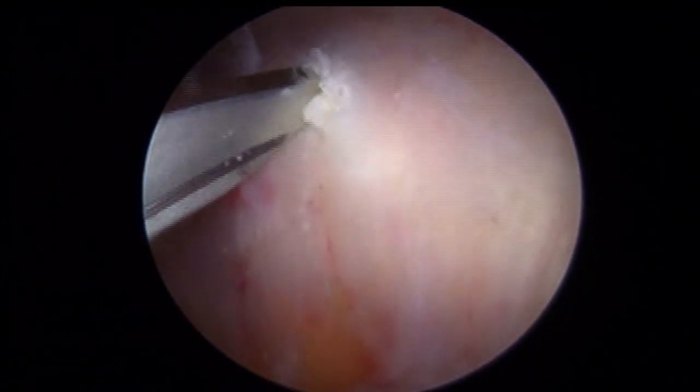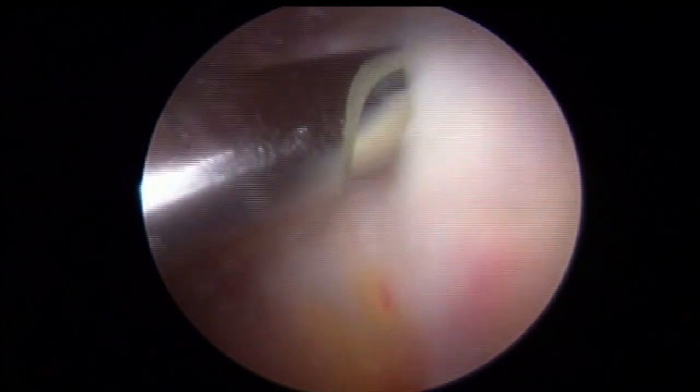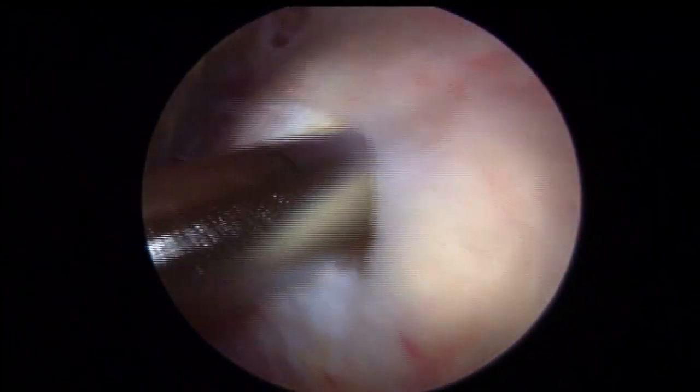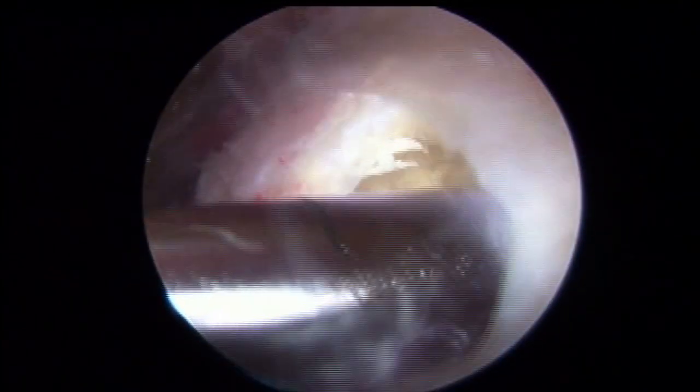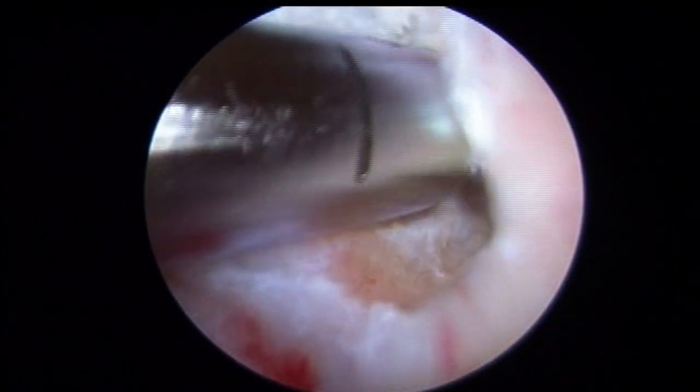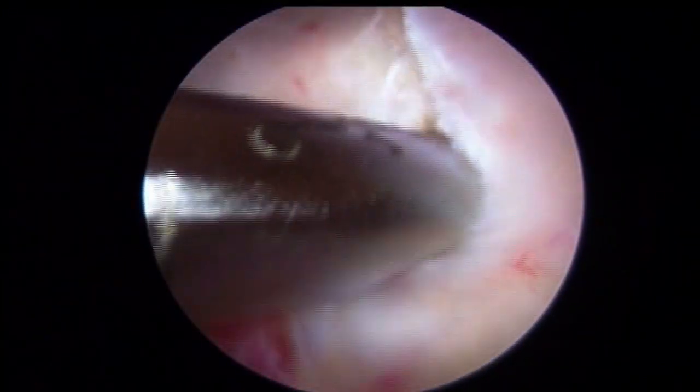A spinal needle is first inserted into the supraspinatus tendon to identify the area of calcification. Next, an 11-blade knife is inserted through the rotator cuff tendon in a longitudinal fashion to allow for excision of the chalky white calcium deposits. An arthroscopic shaver is then inserted into the supraspinatus tendon and the calcium deposits are extravasated and removed from within the tendon. In this case, the calcium deposits extended into the infraspinatus tendon as well. It is important to remove all calcium deposits from within both the tendon and subacromial space, as these can be very irritating and cause significant inflammation if left behind. A curette and probe are used to ensure that all calcific deposits are removed from within the rotator cuff tendons, and the shaver is used to excise all deposits from the subacromial space.